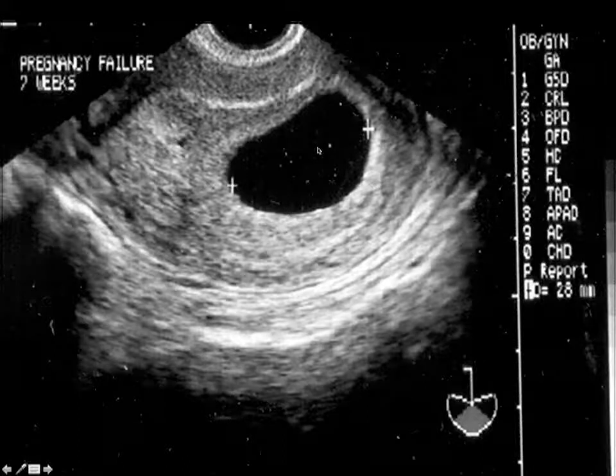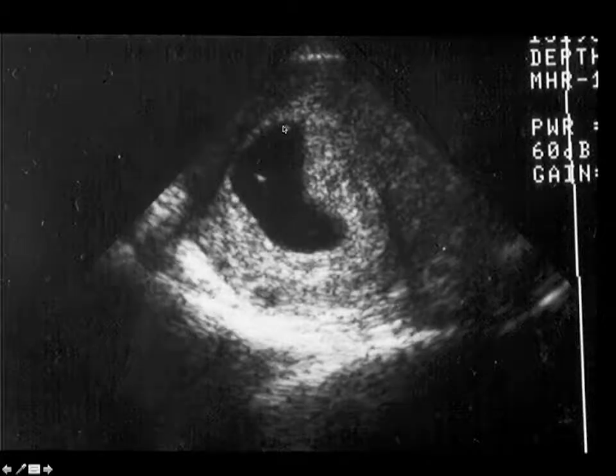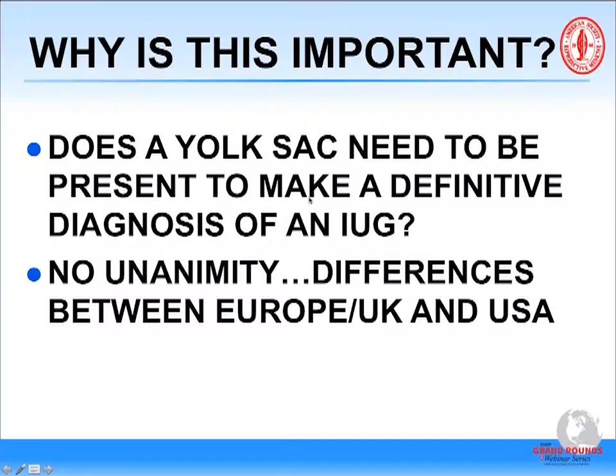No matter how much mom wants a baby, there is no point in doing another ultrasound. There is no point in doing another hCG. This woman has a failed pregnancy. Here's another failed pregnancy with a hydropic yolk sac. Here's a solid yolk sac in a failed pregnancy.